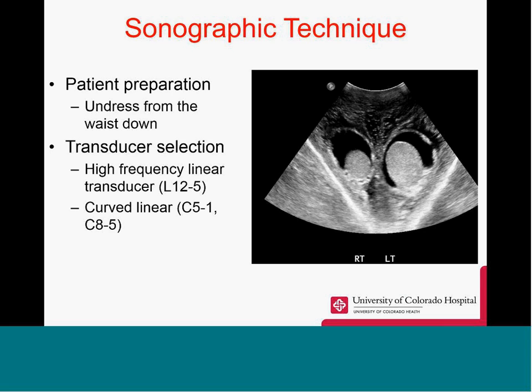Diagnostic ultrasound is the most common imaging technique used to supplement the physical exam of the scrotum and is an accurate means of evaluating many scrotal diseases. Technical advancements in high-resolution, real-time, and color flow Doppler sonography have led to an increase in the clinical application of scrotal sonography. Patient preparation: we will have them undress from the waist down.